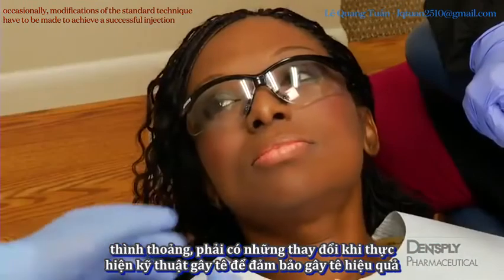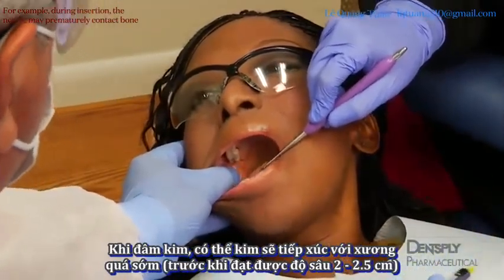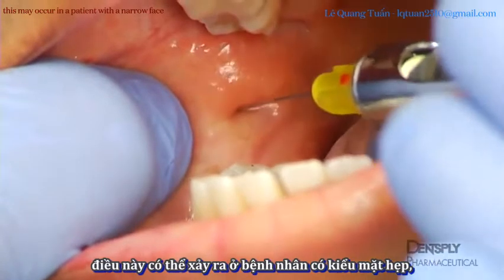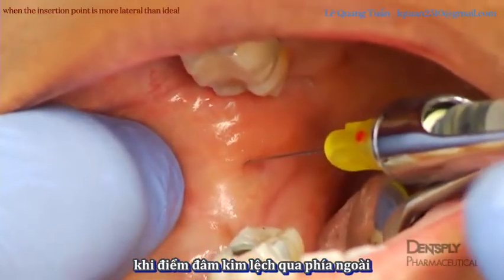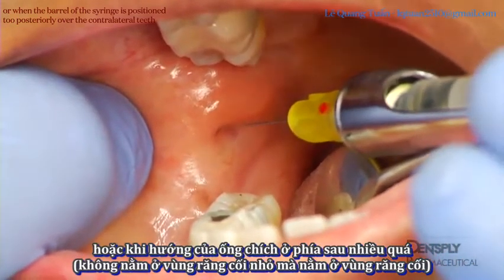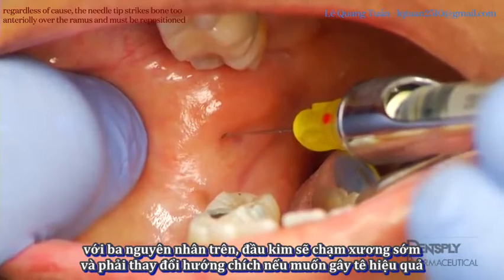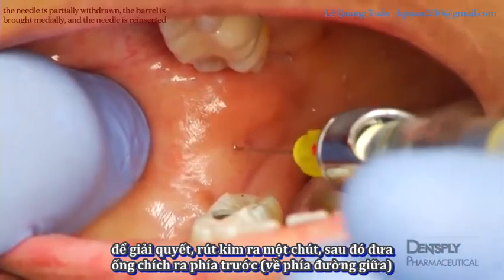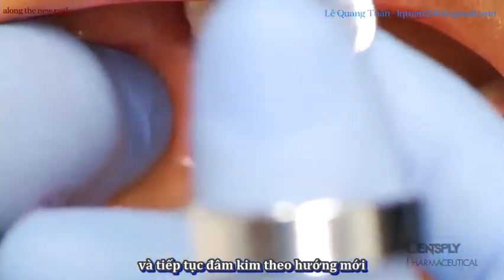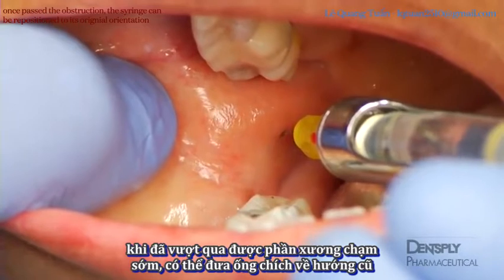Occasionally, modifications of the standard technique have to be made to achieve a successful injection. For example, during insertion, the needle may prematurely contact bone. This may occur when the patient has a narrow face, when the insertion point is more lateral than ideal, or when the barrel of the syringe is positioned too posteriorly over the contralateral teeth. Regardless of cause, the needle tip strikes bone too anteriorly on the ramus and must be repositioned. The needle is partially withdrawn, the barrel is brought medially, and the needle is reinserted along the new path. Once past the obstruction, the syringe can be repositioned to its original orientation.